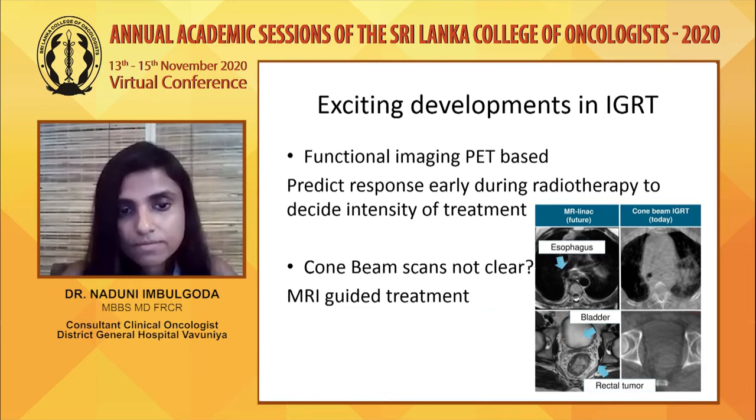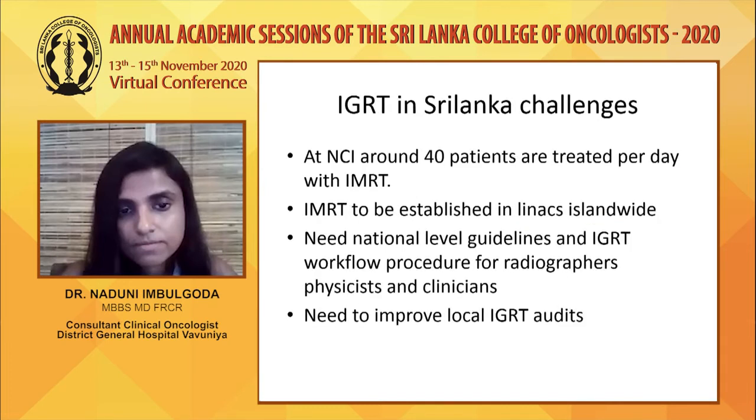So what are the challenges for image-guided radiotherapy in Sri Lanka? At the National Cancer Institute in Apeksha Hospital, we have around 40 patients treated with IMRT every day, and IMRT is planned to be established in linear accelerators island-wide. So we need national level guidelines and IGRT workflow procedures for radiographers, physicists and clinicians, and we need to have levels of escalation. At what point do the radiographers escalate their problems to physicists and clinicians?